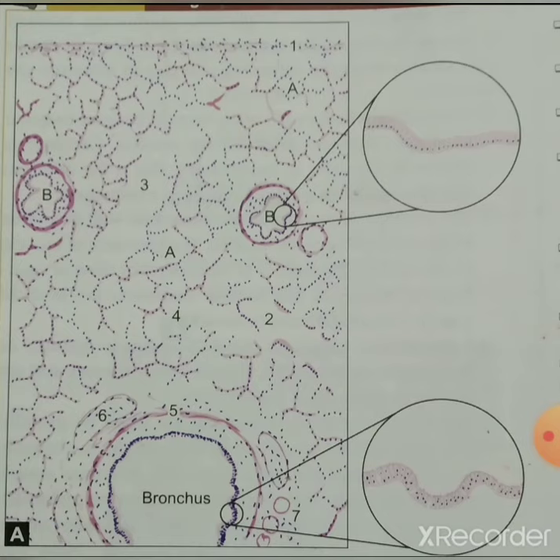and these are called the alveoli, and this is the lung parenchyma. The alveoli give a honeycomb structure here, and they are lined by flattened squamous epithelial cells and filled with air. The intrapulmonary bronchus is lined by pseudostratified ciliated columnar epithelium with few goblet cells, like the tracheal structure.